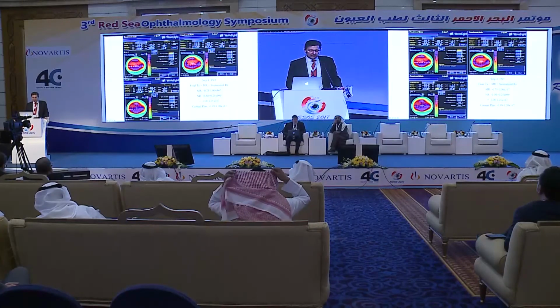So here's our 0 power treatment. And David then does some adjustment to the cylinder to make this more regular. As I say, I haven't been able to reproduce it. But now, on the sphere part, you start adding sphere to make this look like a PTK.